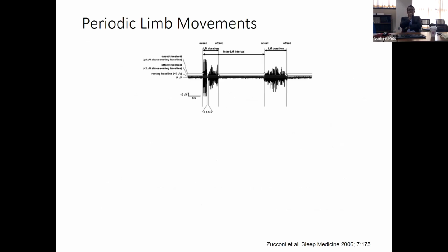Okay. So leg movements, you can look in the scoring manual, and they'll go through the definitions. Much of it really was taken from an international consensus group that helps define what the elements of a periodic limb movement are. You can see there's a lot of components that you're looking for here. And by defining these components, it really does help, particularly for artificial intelligence, in being able to identify leg movements, since these rules are present.